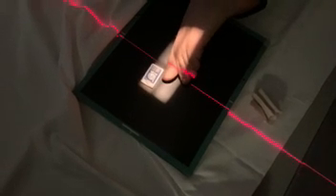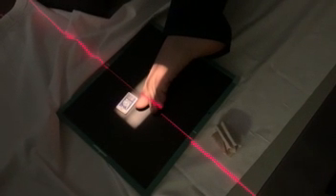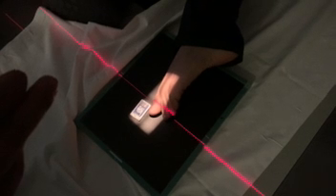Sorry, Daniel. Okay. This is why a lot of techs just prefer to do lateral rotation laterals, even if you have OID. Okay, but for at least the big toe, this is the ideal way to do it. Right, get these toes out of the way, big toe is out, center at the IP with a medial rotation lateral. Okay, very good, Daniel.